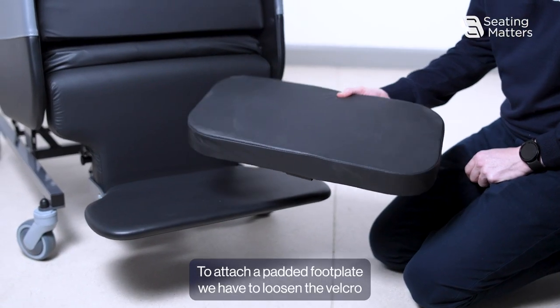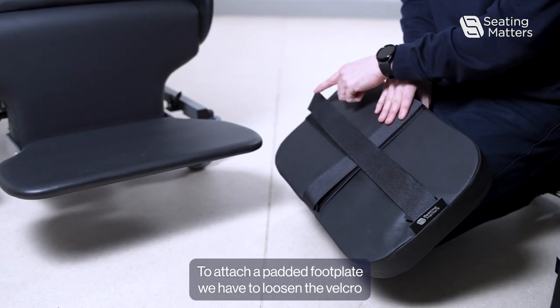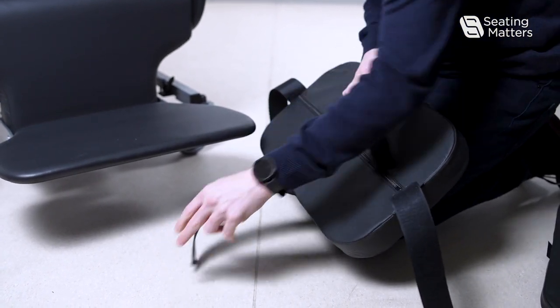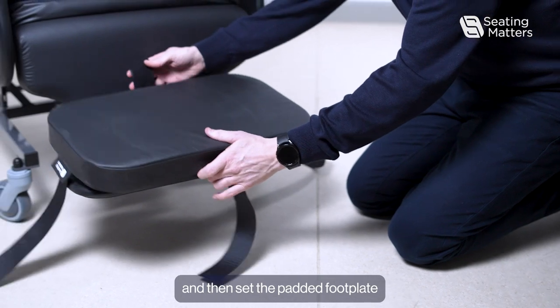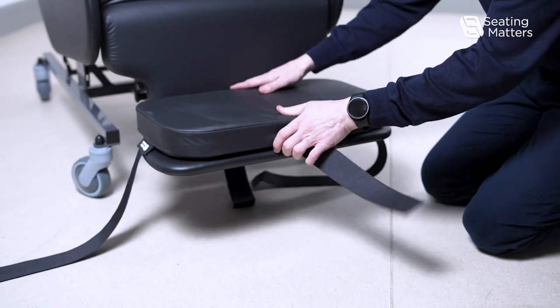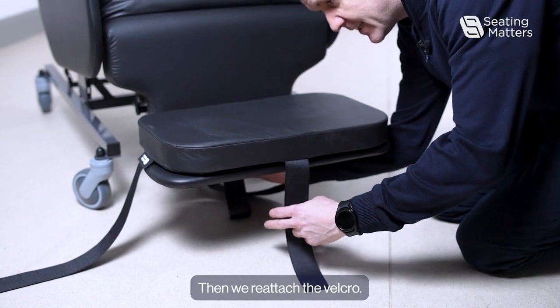To attach a padded footplate, loosen the velcro on the underside, then sit the padded footplate on top of the footplate. Then reattach the velcro.